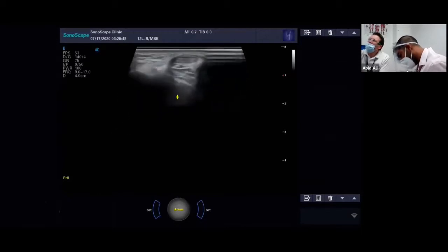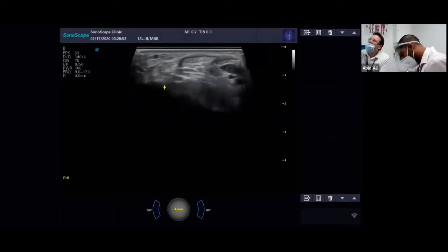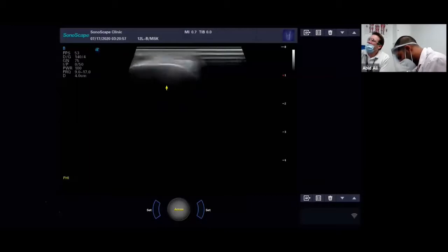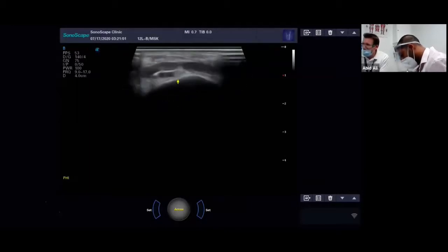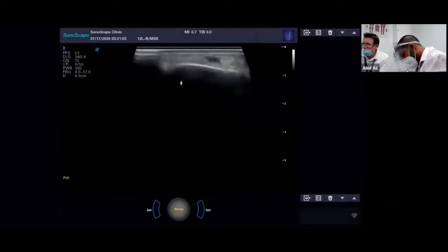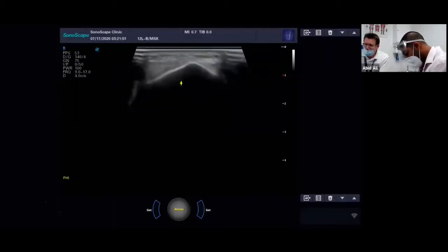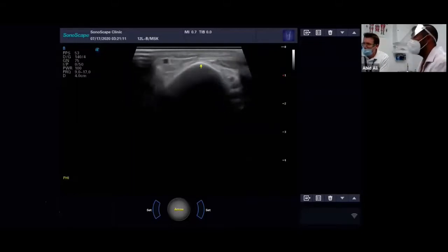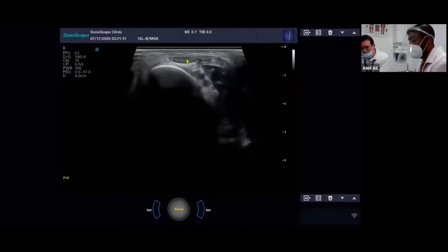It's going to be very difficult to see the whole of the ankle with just one footprint of the probe. It's not broad enough here, and also the ankle is just too curved. So you're going to need to work around it, trying to keep the structure that you're interrogating in the picture. Again, we start at the lower end of the tibia before we get to the ankle. So let's go back to our image there. That's the tibia anterior zoom.